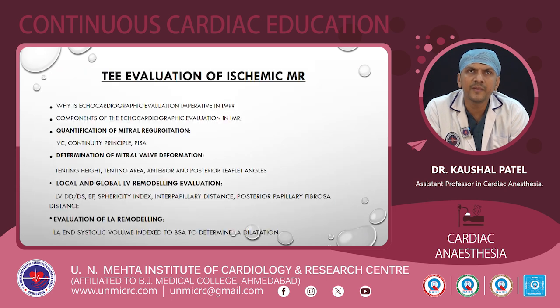Now coming to the TEE evaluation of the ischemic MR. Why is echocardiographic evaluation of the ischemic MR important? Because we have to guide the surgeon whether it is a non-repair mitral regurgitation, or it requires the repair, or it requires the mitral valve replacement. So during the intra-op TEE evaluation, we have to guide the surgeon if it is required for the repair or the replacement. So TEE evaluation is a basic important thing.